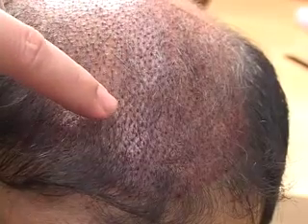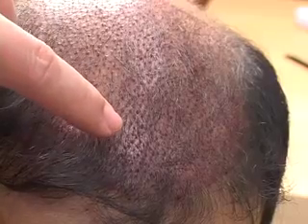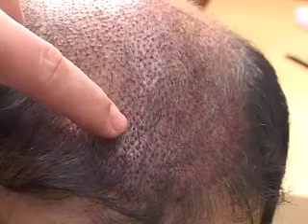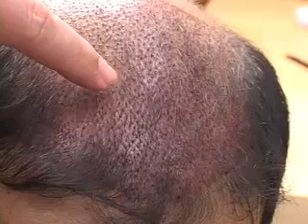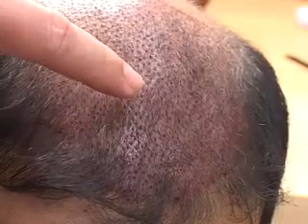If you look very carefully, they're interlocked — what I mean by interlocked is that this graft is placed between those two grafts, and all the way back. That allows truly a very, very tight, dense look that's going to provide a wall of hair where you're not going to be able to see through. They're all angled perfectly, and we're going to show you a couple other transition zones in a moment.